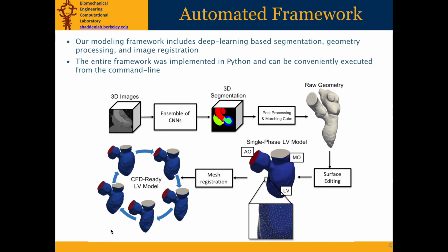Image registration is applied on the segmentation from all collected phases of time series image data to generate deforming volumetric models suitable for moving boundary CFD simulations. The entire framework was implemented in Python and using open-source Python scriptable packages TensorFlow, VTK, SimVascular, and SimpleElastix.